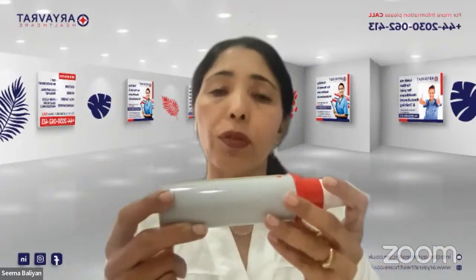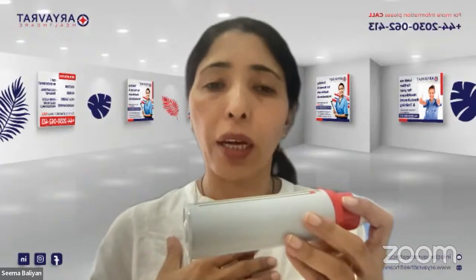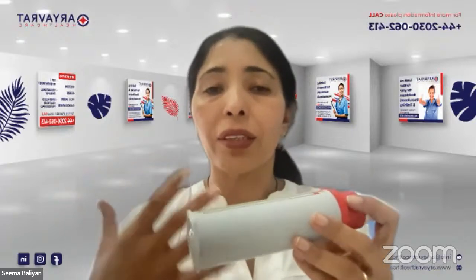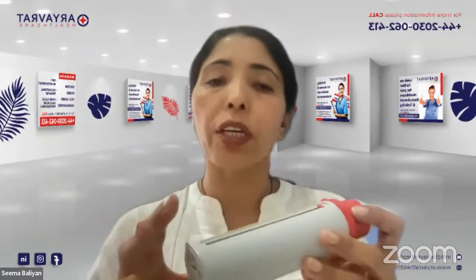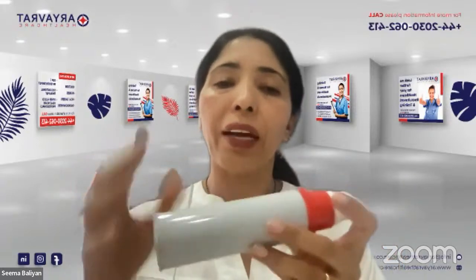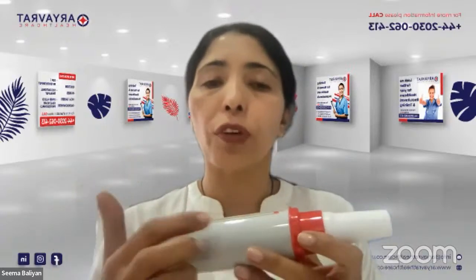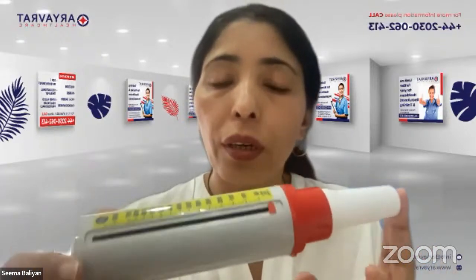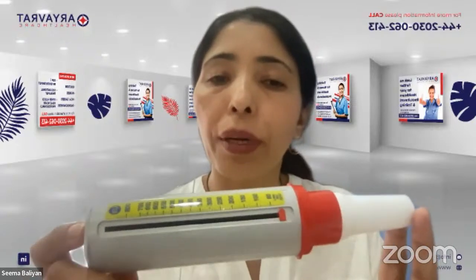But what it is trying to tell you is how much air you can take into your lungs, because when you push the air in your lungs out forcefully through the mouthpiece, that force and that air which comes out is going to give you the reading of your lung capacity. So have all of you understood what this instrument is, why we are using it, and the parts of this instrument?